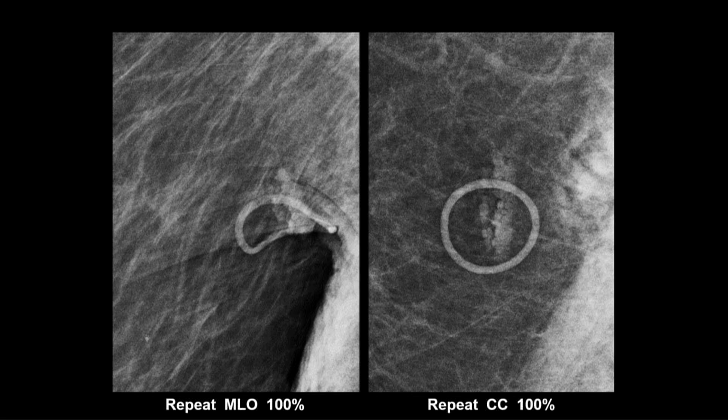That's not true. I don't show most of my cases as tomos for 2 reasons. The first reason is that not all of you do tomo. And for some of you who have tomo, you don't do it on screens. And I'm showing you screening exams. Number two, there's some people who don't have tomo at all. And they're not going to want to spend an hour and a half looking at cases that they don't even have access to. It'll just make them want tomo more. That's fair. So that's why I don't show them. And the third reason, which I don't like to talk about, is I'm really bad at showing movies.